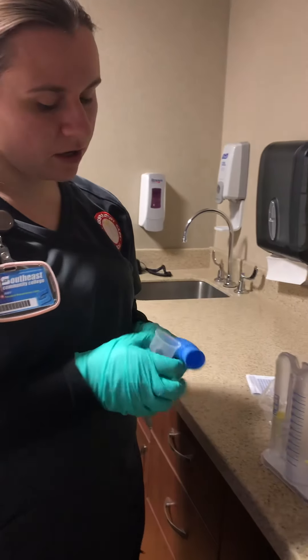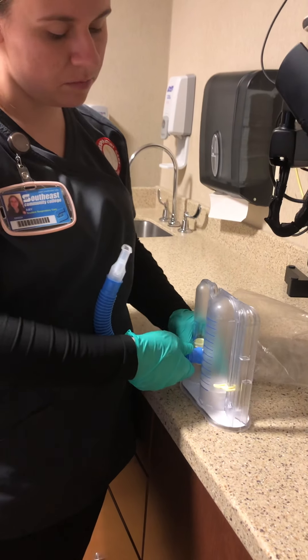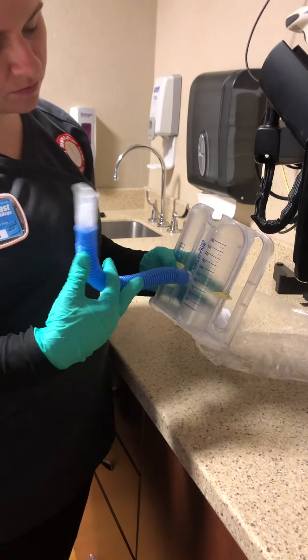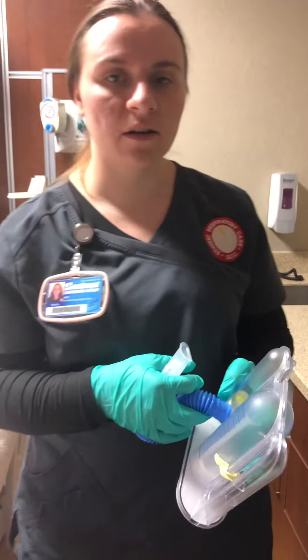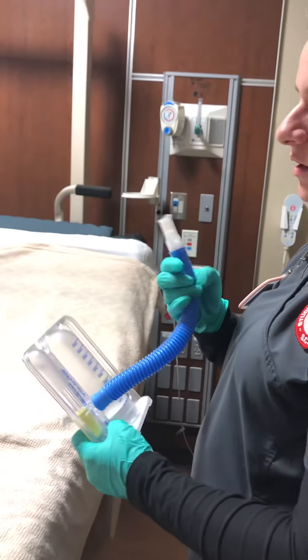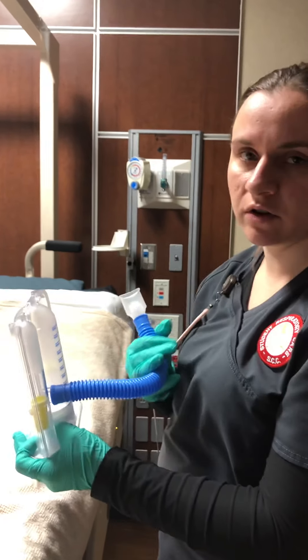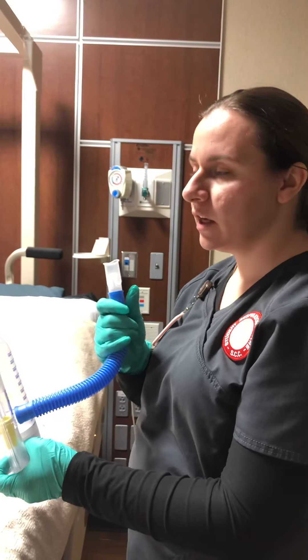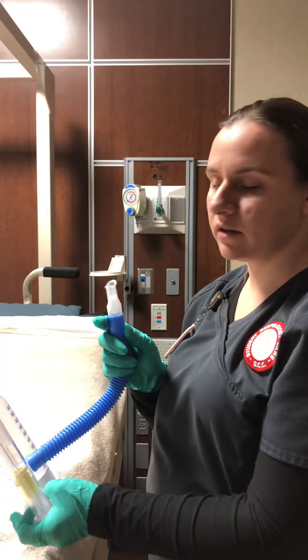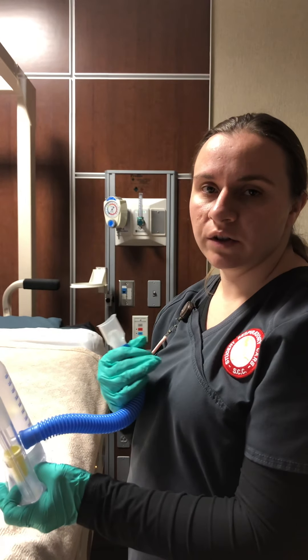I'm going to instruct the patient on how to properly use it before they do it. I'll show them how to tightly insert the mouthpiece and set the goal marker to where they need to be. I'll have the patient take a nice deep breath in, exhale fully — all that air out — and when they go to inhale again, put a tight seal around the mouthpiece with their tongue underneath, not occluding it. Then take a nice deep breath in and hold it for three to five seconds.